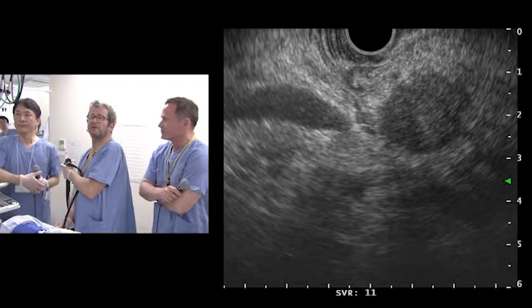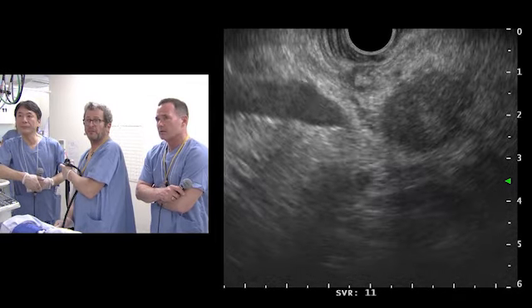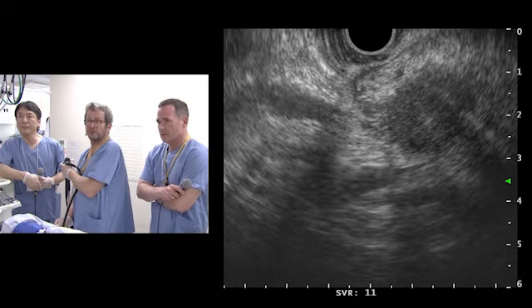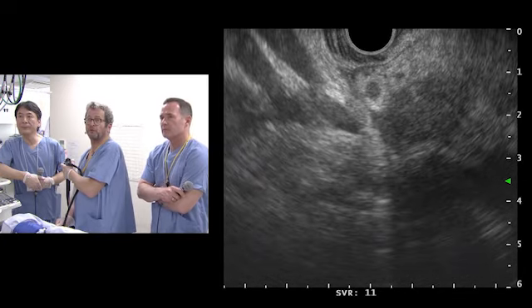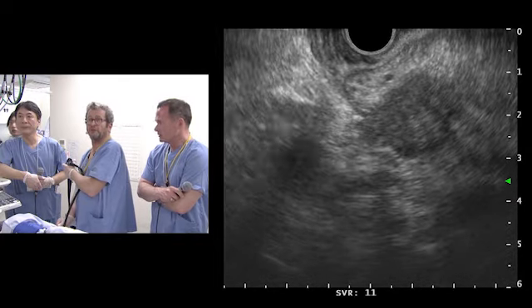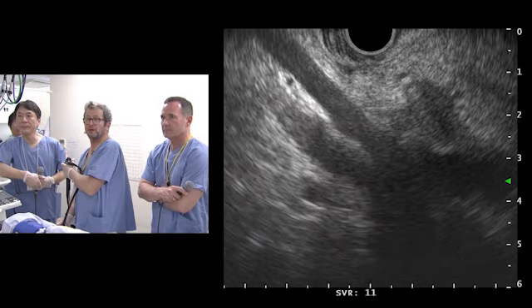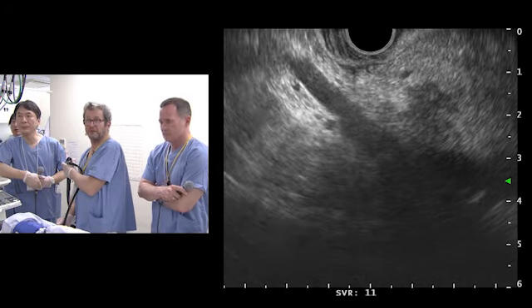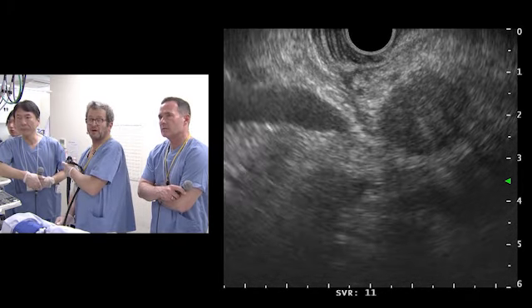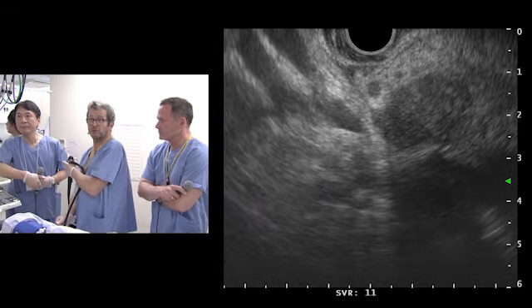You see, in this case, we are in a good position to make the puncture. But when we push the needle, we pass through at least 1 centimeter or 1 centimeter and a half of normal tissue, and with some vessels, as you can see. So I don't see the role of taking risk, especially because in this case the lesion is small, less than 20 millimeters, and with no invasion of the portal vein.